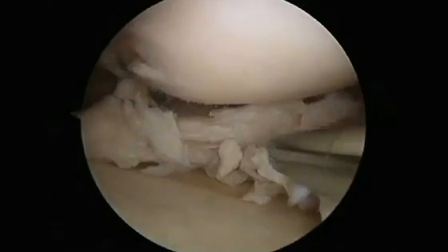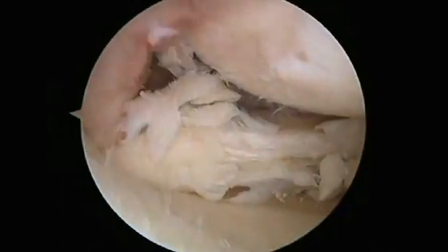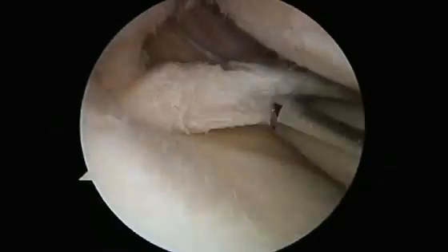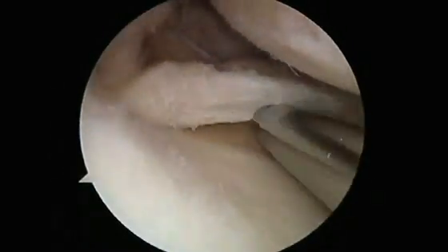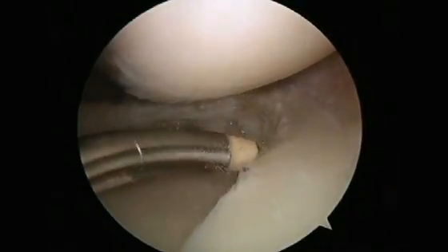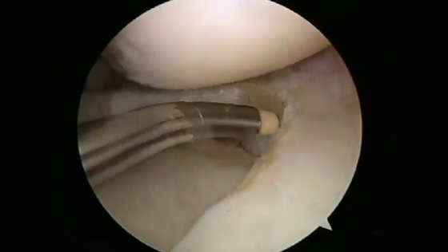As a last step what I like to do is use an electrocautery device to contract and stabilize the rim of the meniscus to smooth it out and also to prevent re-tears. The key for meniscus removal if there is a significant tear is to remove any loose fragments that can move, that can get pinched or impinge in the knee or can get caught. The main principle of partial meniscus removal surgery is to remove all loose fragments of meniscus that are torn, loose, and unstable and that might get pinched or caught in the knee and cause persistent pain. So it's important to remove all the loose fragments — that's why you frequently check as you're removing parts of the meniscus to make sure there's no further loose fragments.